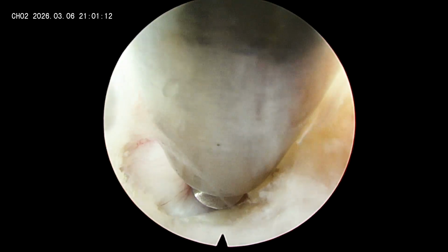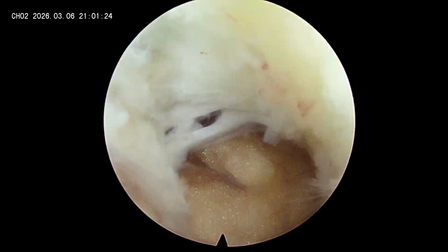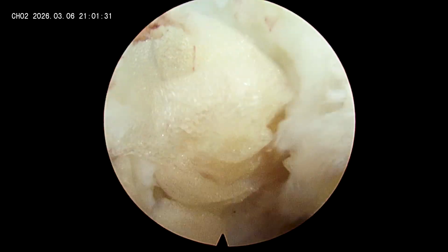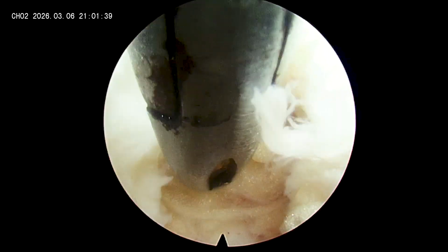Again see the structure which is in front of me. I don't know whether it is the traversing nerve root or whether it is the disc. So don't be in a hurry to try to remove the disc fragment here. I would suggest you create this space, make the traversing nerve root visualized more clearly, identify its lateral border, and then try to remove it.